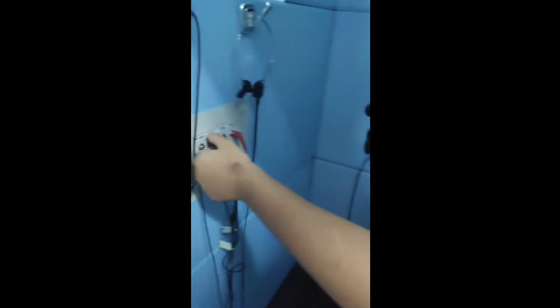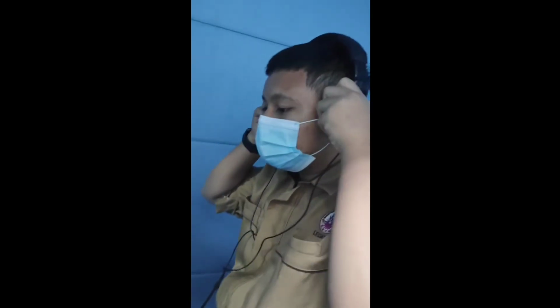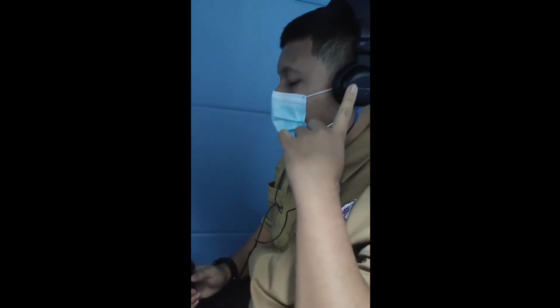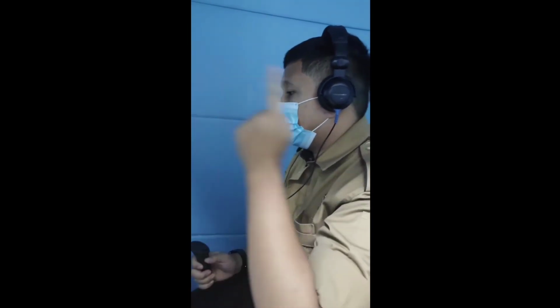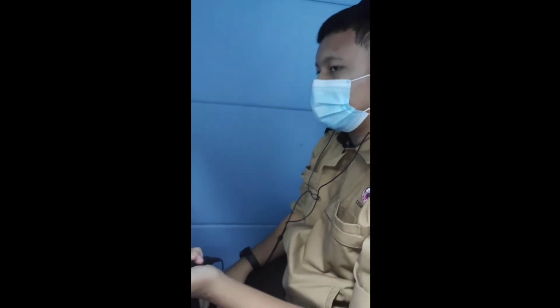For the headphone, the blue color is for the left ear, the red color for the right ear. The subject will wear the headphone. When the assistant gives the tone, the subject will press the button when they hear the tone sound. This test we do part by part. For example, test the right ear and then the left ear.